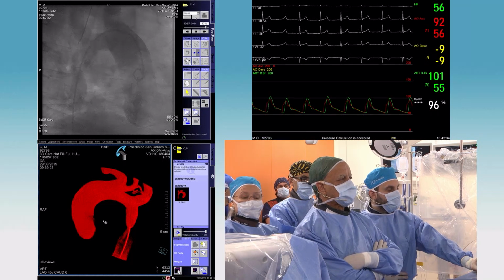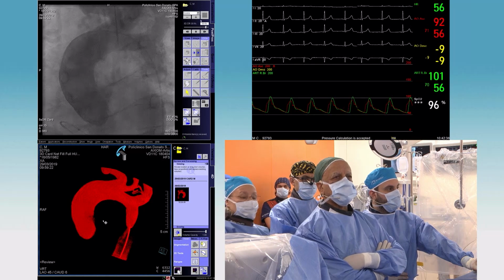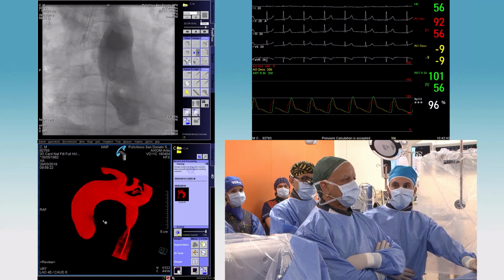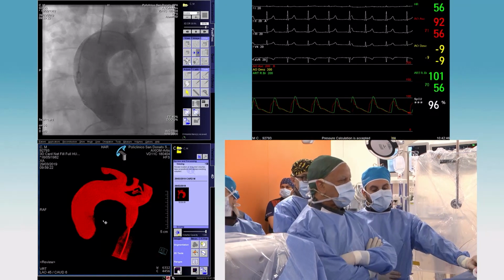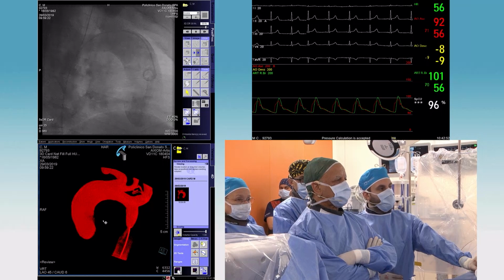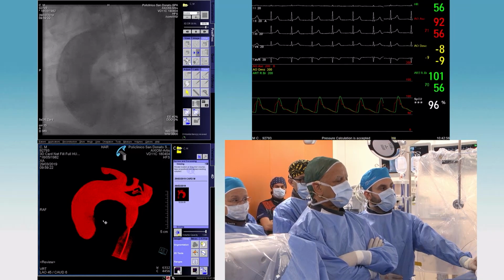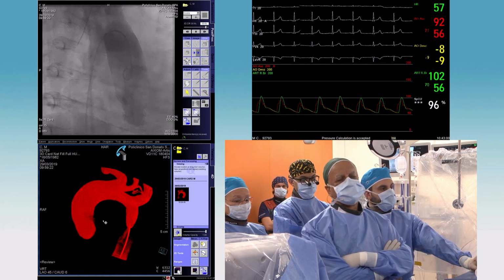This would give you a longer stent or just cover the coarctation itself. Yep, very good. So very good point. My thought was also along what you were just suggesting, because the distal aorta isthmus region is hypoplastic. So I was thinking of putting a longish stent to cover that part as well as the coarctation.